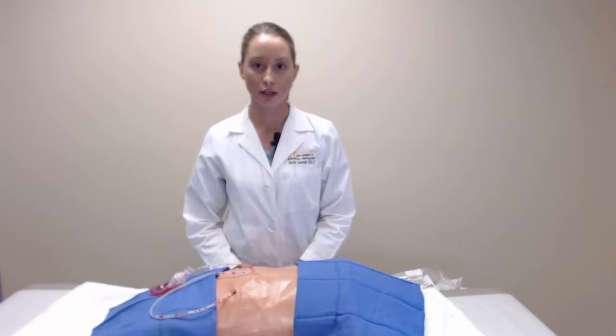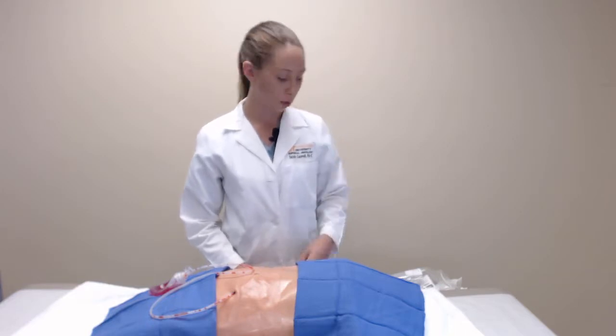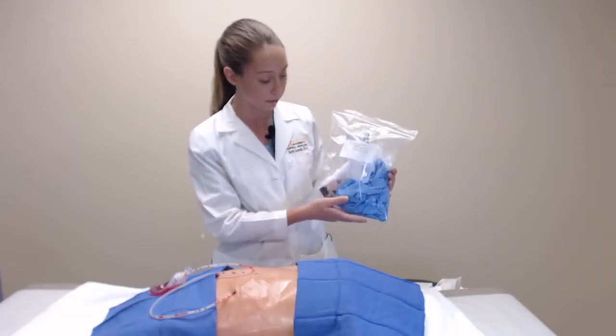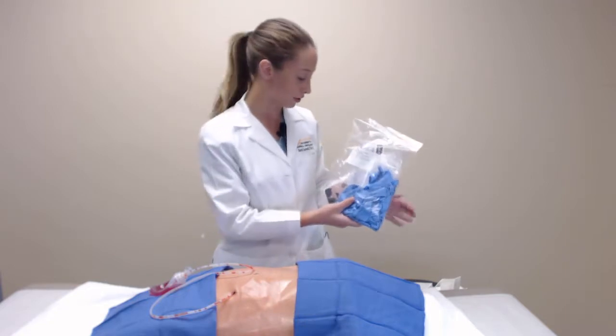I'm a physician assistant at the University Surgical Oncology Group at the University of Tennessee. Today we're going to go over the care for your JP drain that you received after your surgical procedure. To start, we're going to go over your drain kit that you should receive before going home from the hospital. This kit includes a measuring cup, gloves, and 2 waist belts.